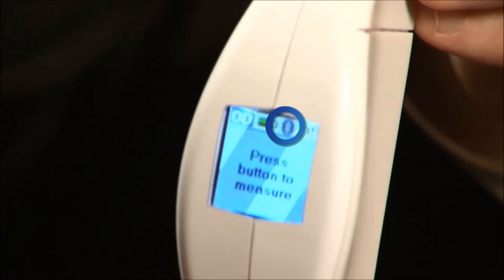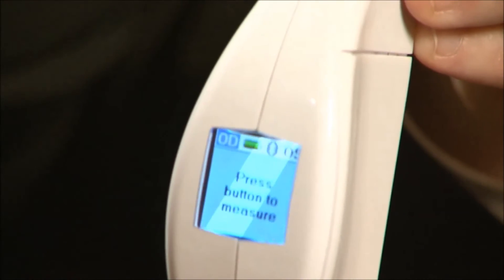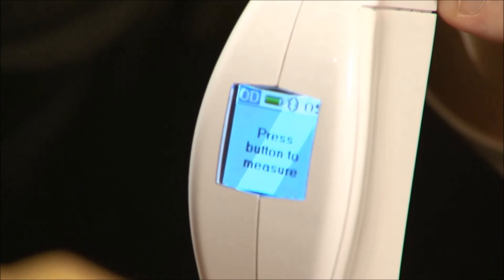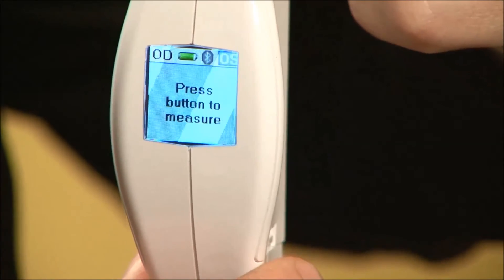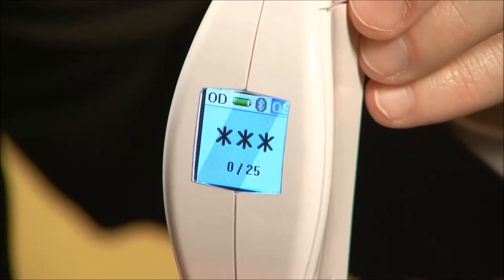This device does have Bluetooth wireless communication. Once you've made a measurement, you can wirelessly transmit that data to our optional Bluetooth printer or to a Bluetooth-capable data collection device. When you're ready to make a measurement, you simply push the button one time. When you see three stars on the screen, the instrument is ready to take a measurement.